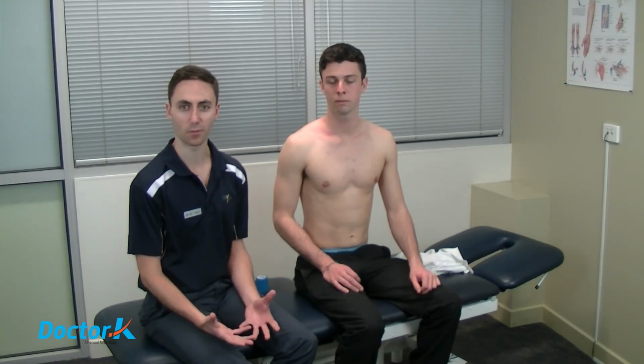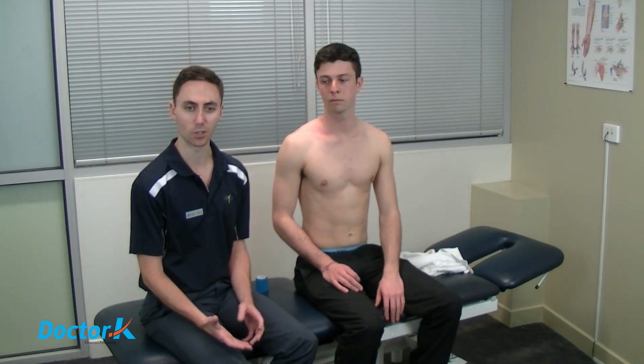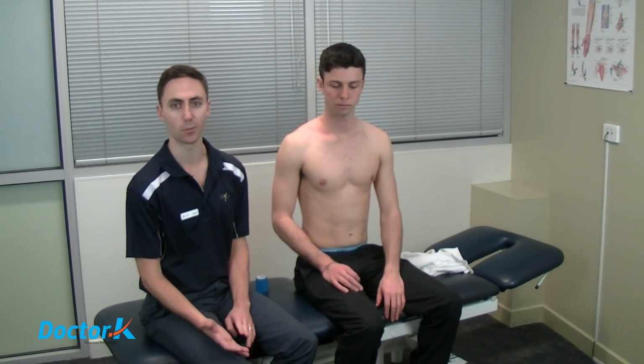And today we're talking about how you can use Dr. K Kinesiology Tape to help with shoulder pain. So this application can be used in a few different types of shoulder injuries. You could use it for rotator cuff pain, or possibly bursitis, or even for some sort of postural correction for your shoulder as well.